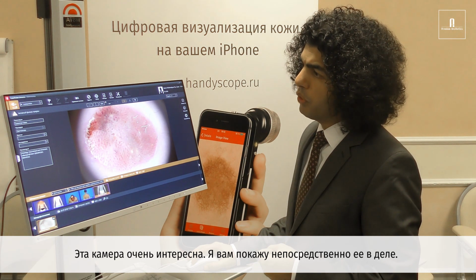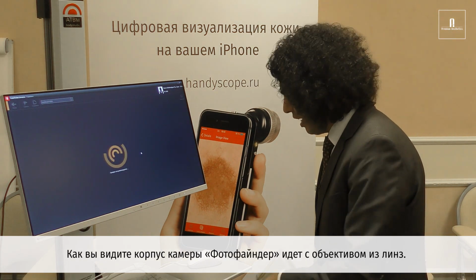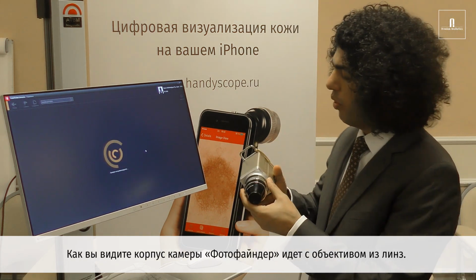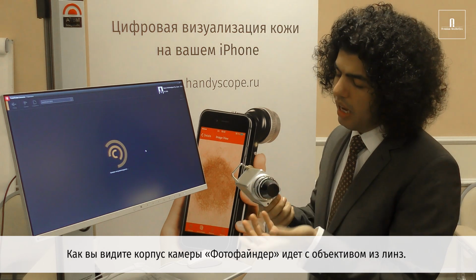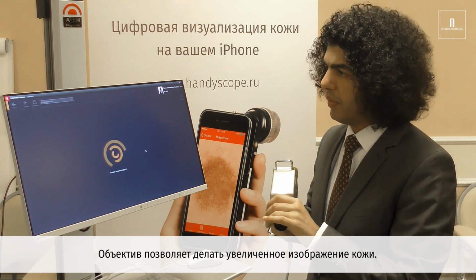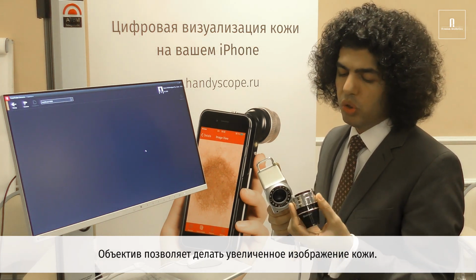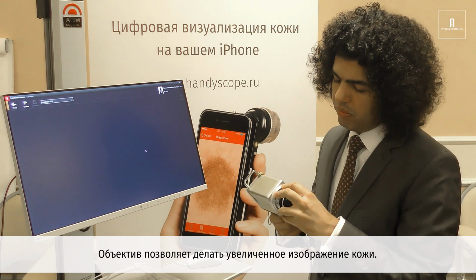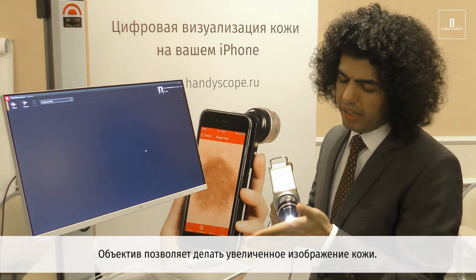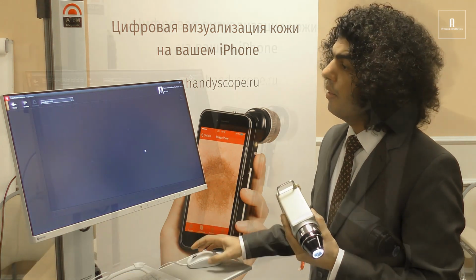I would show it to you maybe on a live case. As you see, the FotoFinder in this case comes with a camera and a lens. The lens allows you to basically do quite well magnified pictures of the skin.